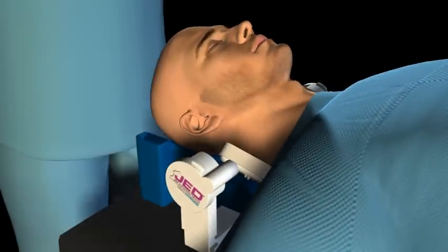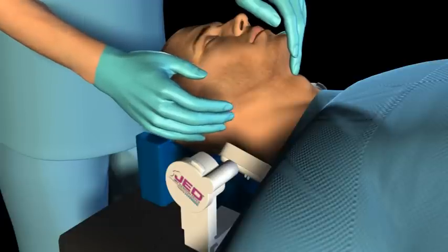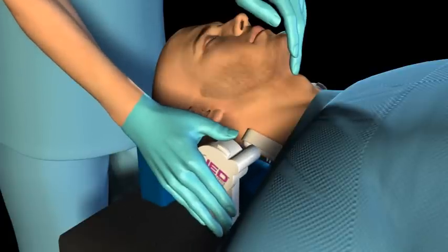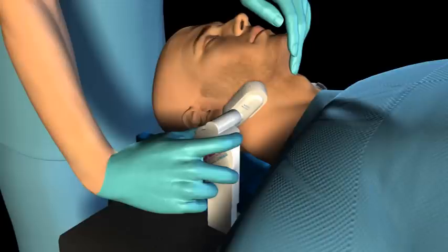After administering sedation, place the patient's head in a proper sniffing position and verify adequate air exchange via chest excursion and/or expired CO2 waveform. Use the left hand to hold the head position constant, then use the right hand to palpate the angle of the mandible on the right. Next, slide the vertical support arm inward toward the patient's jaw until the mandible cup is posterior to the angle of the mandible. Then lift the arm up and rotate back until the mandible cup firmly cradles the angle of the mandible.